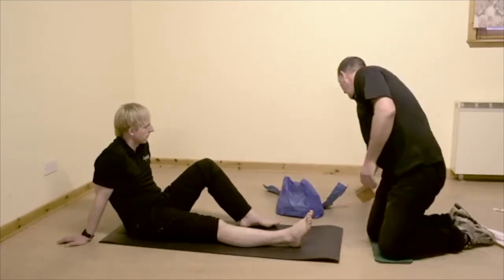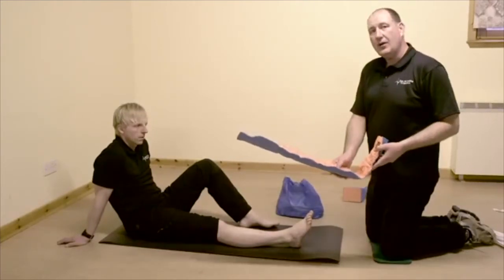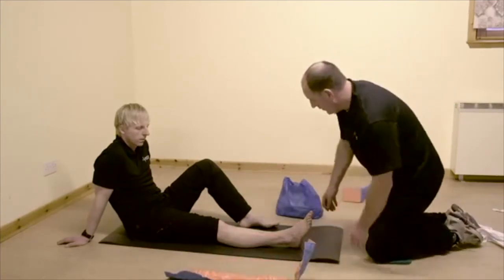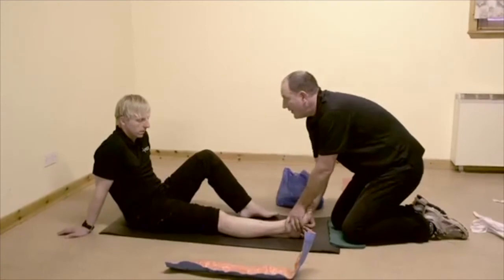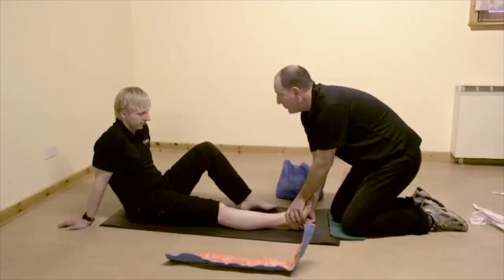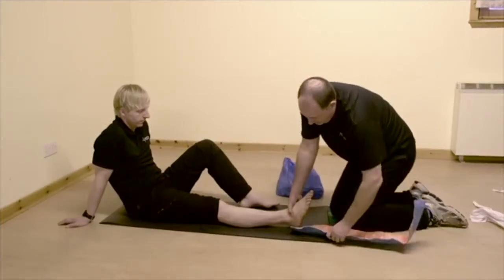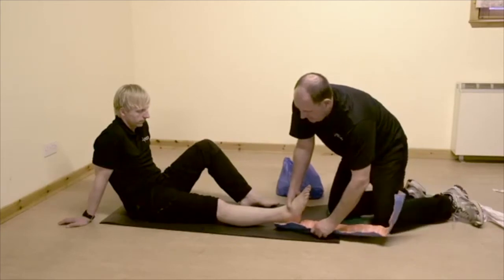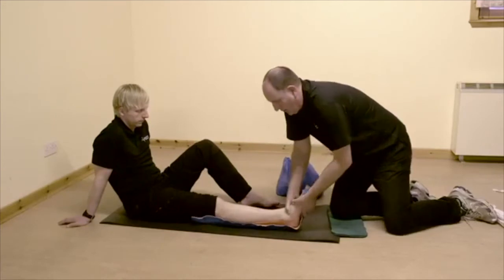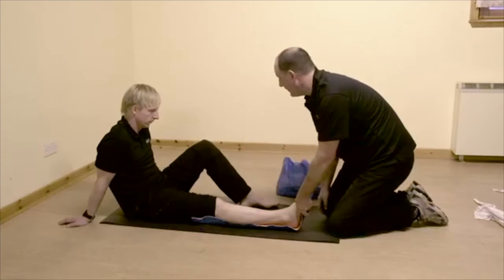Here's one that we have made as a leg splint earlier today, which we're going to use to show how we can stabilize Tom's lower leg injury. I will have relocated Tom's leg so we've got it nice and straight - well done Tom, that was very brave. What I'm going to do now is very gently take my Sam splint and slide this just underneath your leg, and then we're going to tie his foot and leg to this Sam splint to keep it stable.